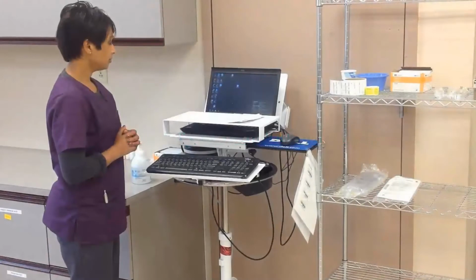Welcome to the Pomeroy College of Nursing Lab. The following is a demonstration of the skill validation primary IV infusion administration using the MAC system.